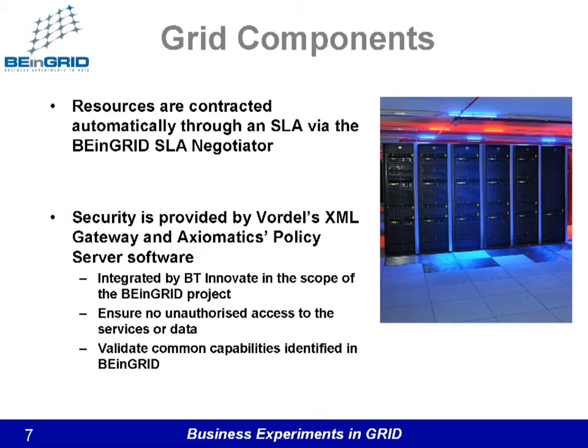Radiotherapy Grid is secured against unauthorized access through the use of Vordel's XML gateway and Axiomatic's policy server software. These commercial components are validations of common capabilities identified in the BeInGrid project.